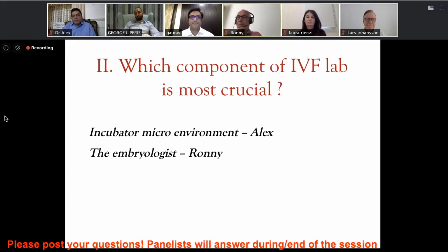In one word, that would be temperature. The reason is because temperature is associated with so many different processes within the IVF laboratory. So we have the handling stages where we handle our gametes and embryos at the laminar flow hood, at the X-rig, at the tube warmers. We have the incubator itself, where again the temperature is variable between shelf to shelf. We have the culture media as well, and its stability during transportation and during storage.